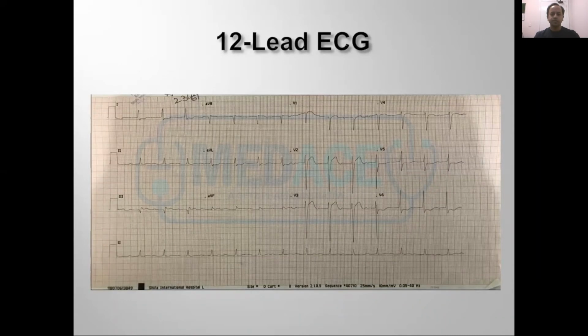So the initial ECG that was done at presentation shows a sinus rhythm with first degree AV block, and there were significant ST elevations in the anterior leads and ST depressions in the lateral leads.